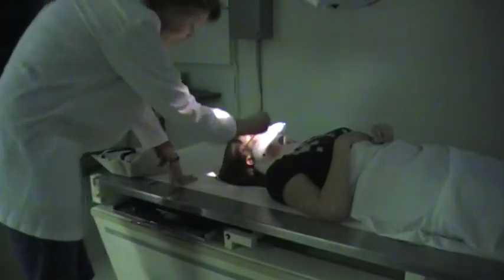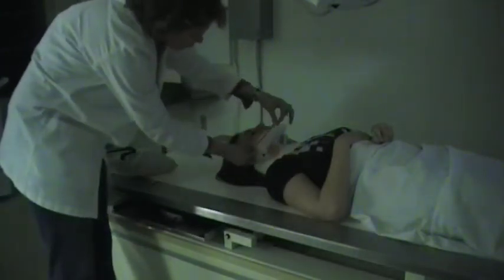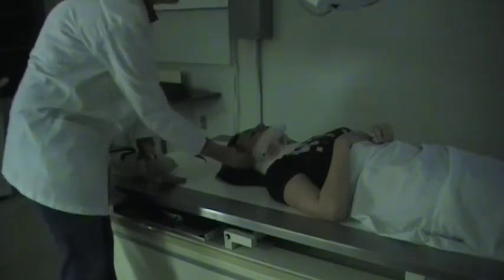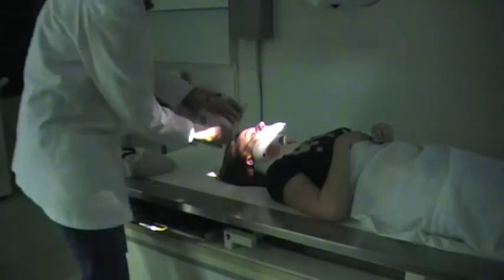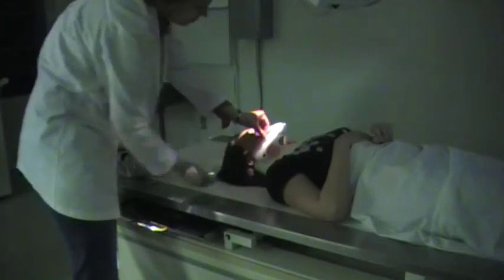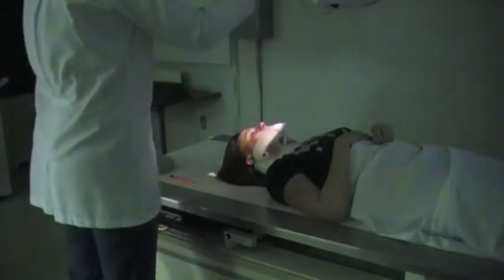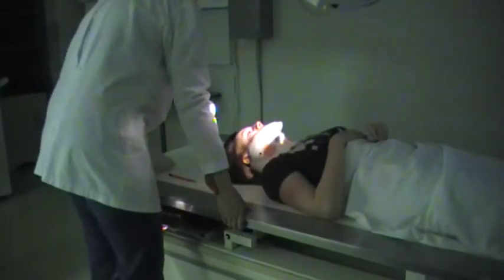usually what's perpendicular on the normal patient. And with our trauma patient, our MML line is going like this. So you want to go ahead and angle your tube, which I've already done, to equal this MML line. So it's going to be parallel with this line. Second, our central ray is still going to enter in at the acanthion.